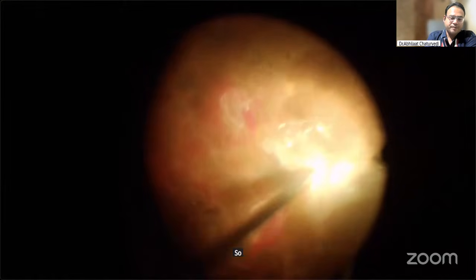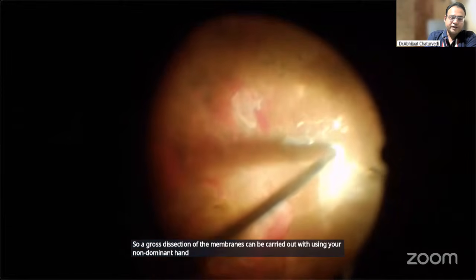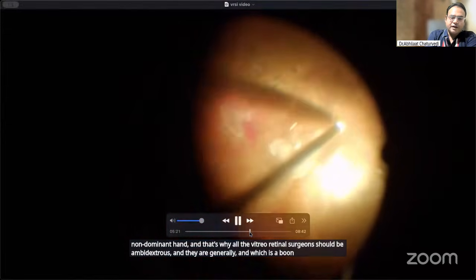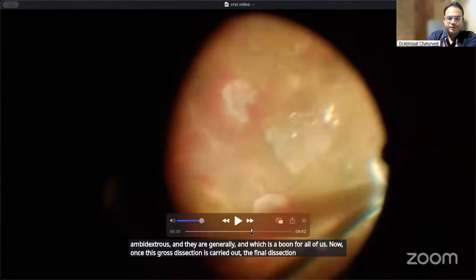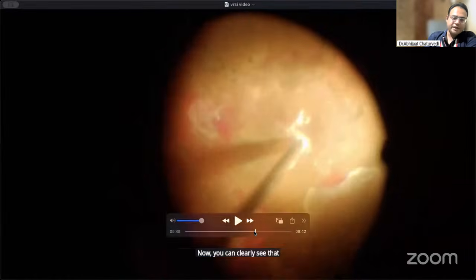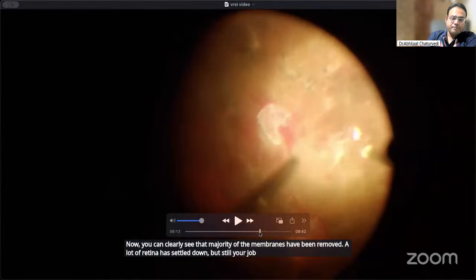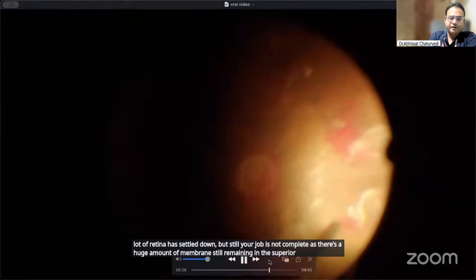So a gross dissection of the membranes can be carried out using your non-dominant hand. And that's why all the vitreoretinal surgeons should be ambidextrous, and they generally are, which is a boon for all of us. Now, once this gross dissection is carried out, the finer dissection and the part that needs to be finished up can be done using the dominant hand again. Now, you can clearly see that the majority of the membranes have been removed. A lot of retina has settled down, but still your job is not complete as there's a huge amount of membrane still remaining in the superior half of the retina, and that also needs to be tackled now.